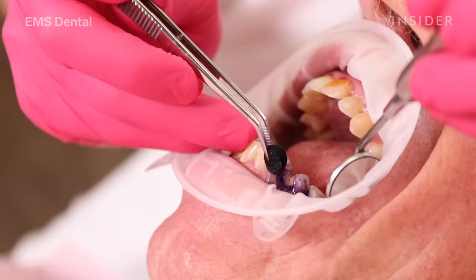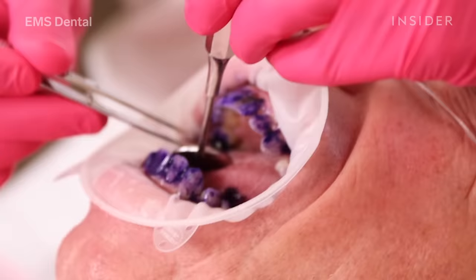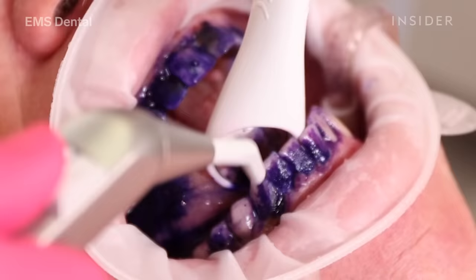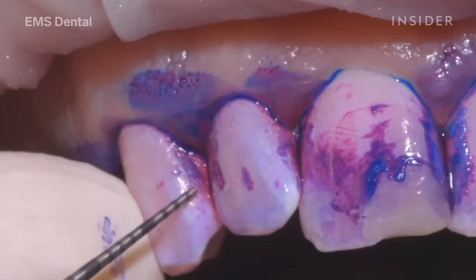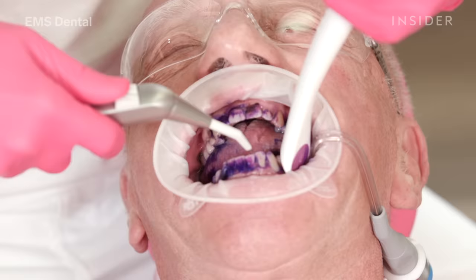One of the problems with biofilm is that you can't see it and you can't feel it, so I use a dye called biofilm disclosure, which is an organic coloured dye. When the dye is applied to the teeth that have biofilm on them, it changes the colour of the biofilm. It's a clever two-tone dye: it stains early biofilm, which is less than three days old, pink, and it stains mature biofilm, which is more than three days old, blue.